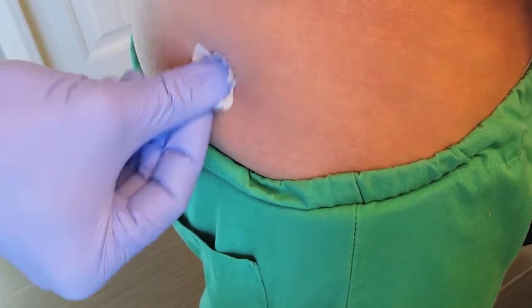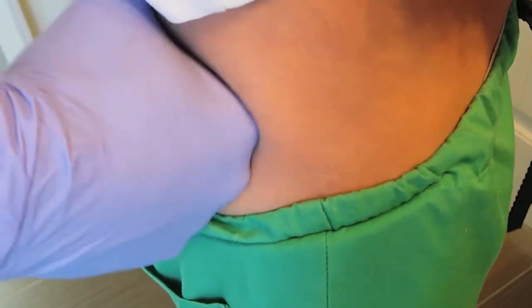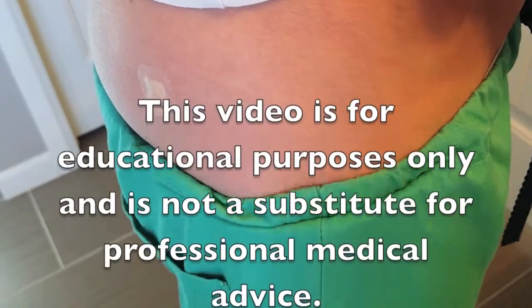If you do see a little spot of blood, that's normal — nothing to be worried about. Usually just clean that off with an alcohol swab. If you do continue to have a little bit of bleeding, you can always place a small bandage on the site. Oftentimes, after an intramuscular injection, it is a good idea to massage the site with your fist or hand for 10 to 15 seconds. This helps to disperse the solution and may help decrease any soreness following the injection. And that concludes our demonstration of preparing and administering an intramuscular injection. Thank you very much.